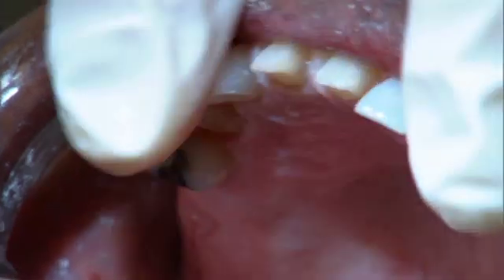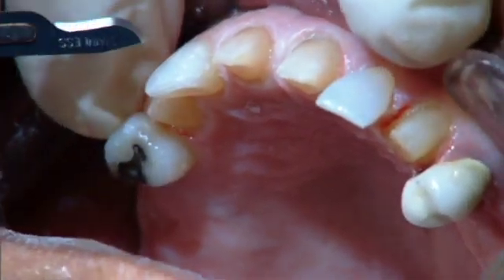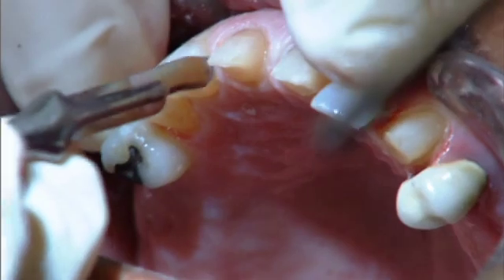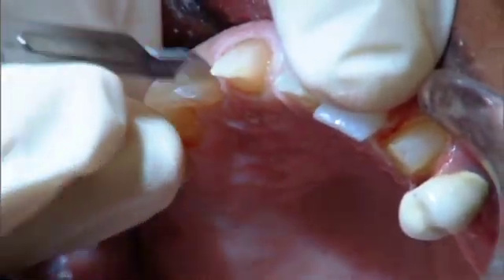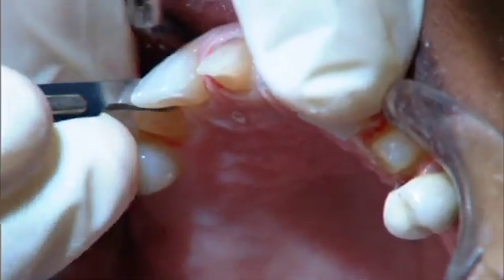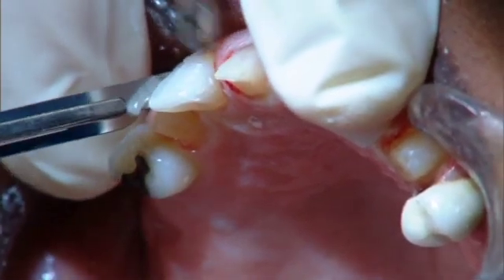We'll have the ability to go back and refine these preparations, but we're going to get a lot of soft tissue changes. I'm going to go ahead and remove tooth number 7 and number 10. The periodontist has deemed them hopeless. We have a 9mm probing depth on the mesial and about a 12 on the direct distal.